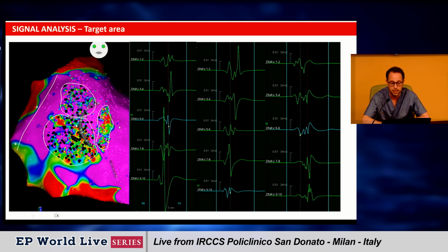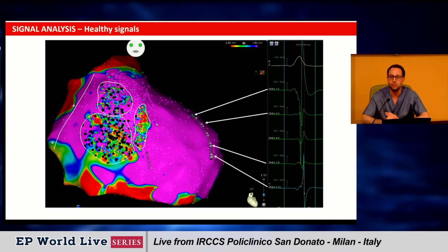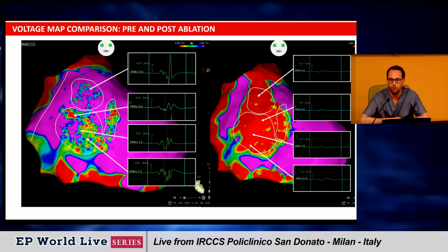And all these areas in the epicardial region, which are the outflow tract and the anterior wall of the right ventricle, are characterized by clustering of late abnormal electrical activity with fractionation and low voltage amplitude. These are typically observed in patients with this kind of J-wave syndrome. And if we compare, the left ventricular aspect is characterized by high amplitude, highlighted in purple, and absence of late activity, which is clearly the case in the absence of abnormalities.